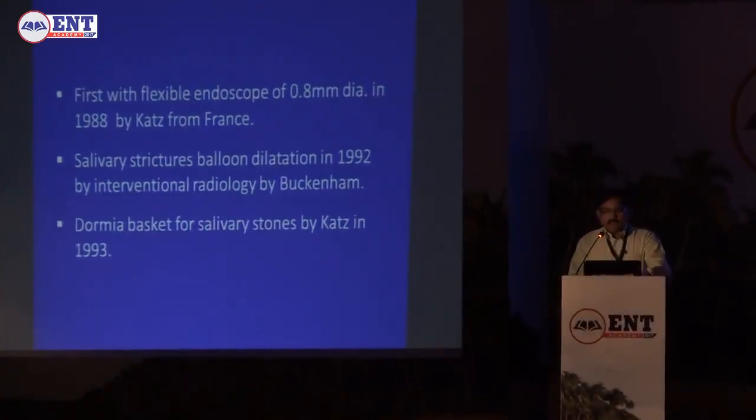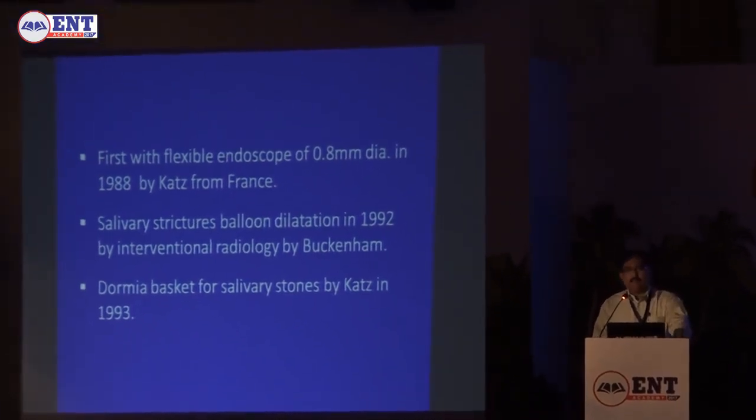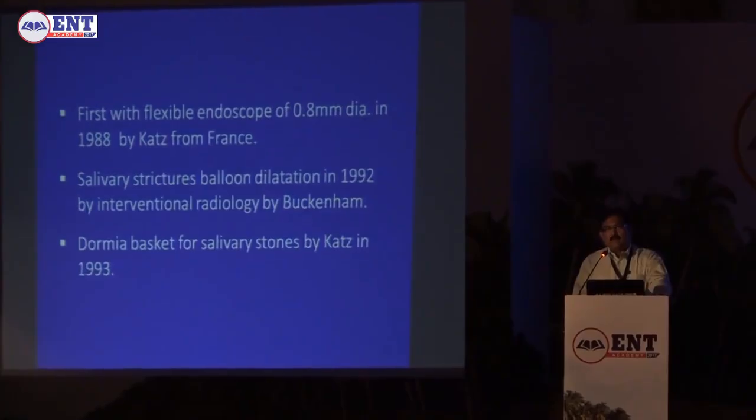These are not new. Salivary endoscopies have been done for a long time by people using various equipment. There was a group of endoscopes by the name of microendoscopes, originally introduced in engineering and brought in for eustachian tubal endoscopy sometime in the 90s. And they were all used. So there is nothing new.